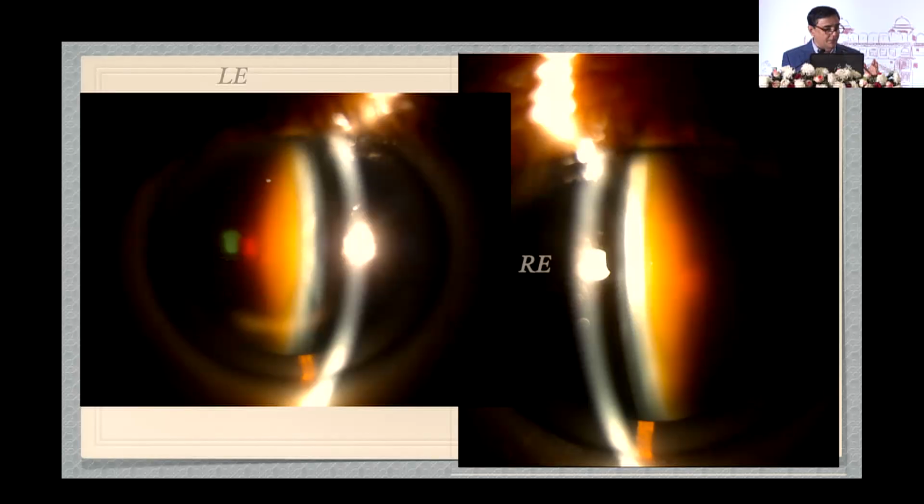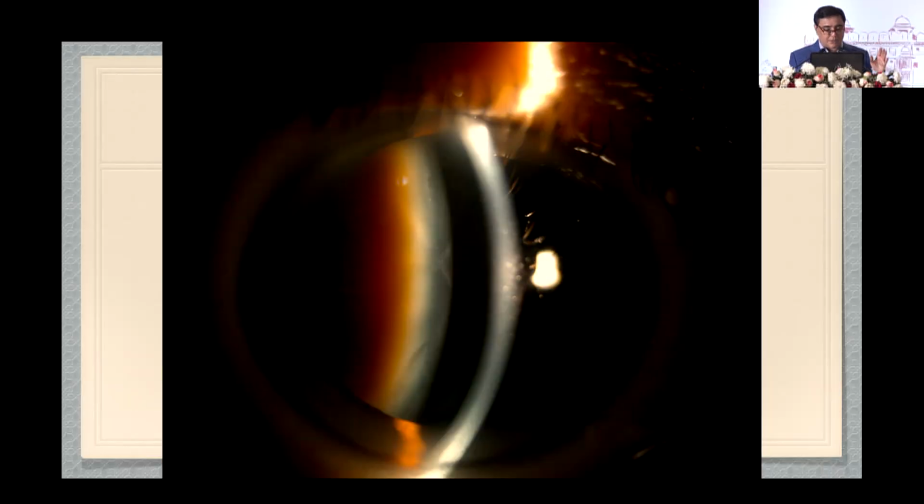Thank you. So I'm going to show you a case, and I want active participation from the audience. Let me show you the right eye and the left eye. I also have a photographic slit lamp from Topcon, and with any slit lamp you try to put light from the front, it won't penetrate the anterior third of the nucleus, and you can't see the posterior capsule at all. Any full power, nothing, you could not go beyond this. So this is one eye.